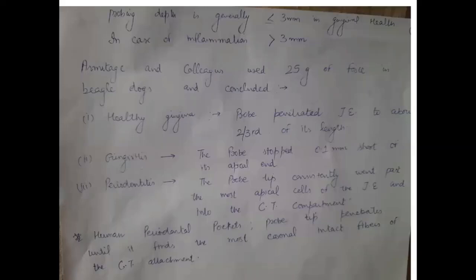So in case of healthy gingiva, the probe tip is stopped in the junctional epithelium only. While in case of gingivitis, when there is inflammation of the gingiva, the probe penetrates up till 0.1 mm short of the apical end of the junctional epithelium.